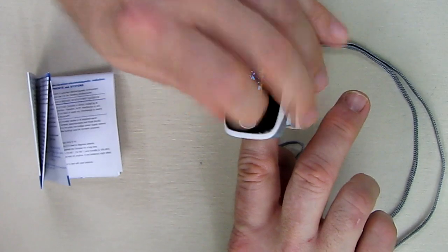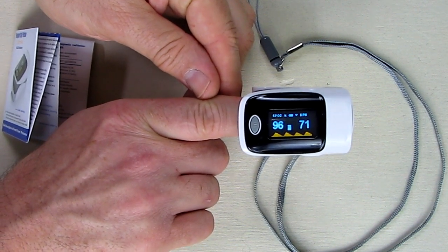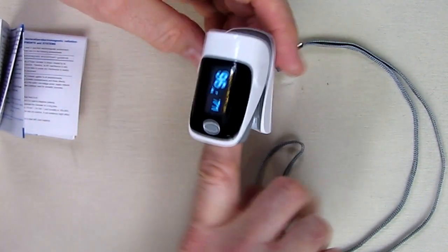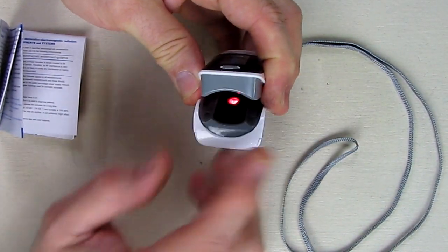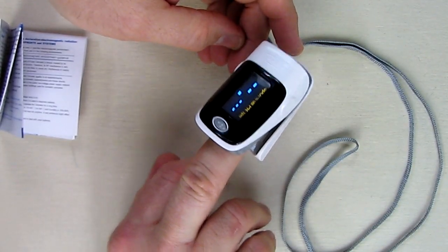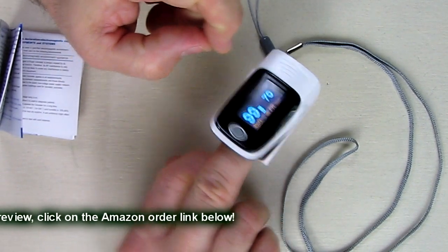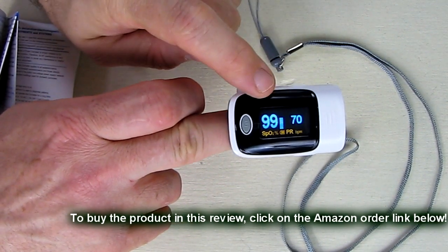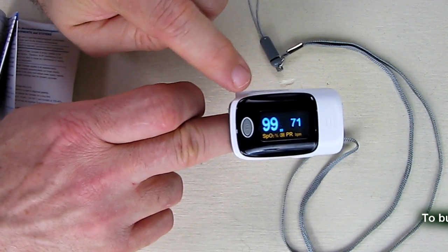Hit it again and now it's going in this direction with that little display. What's neat is that you have the option of changing the display and looking at the information in different orientations. It's very simple to use — you're essentially just putting your finger where the LED is. The display shows 99 percent oxygen and a pulse rate of 70. You can just move that button to get your different display.